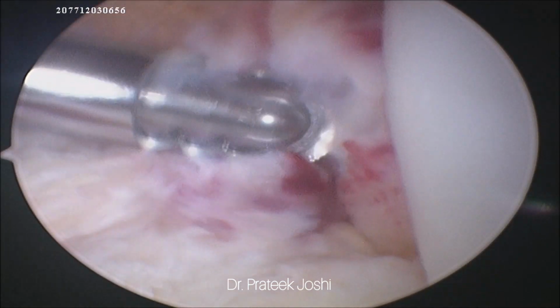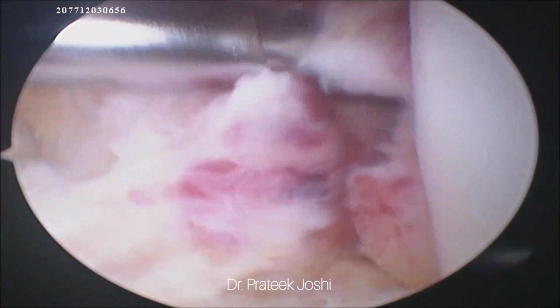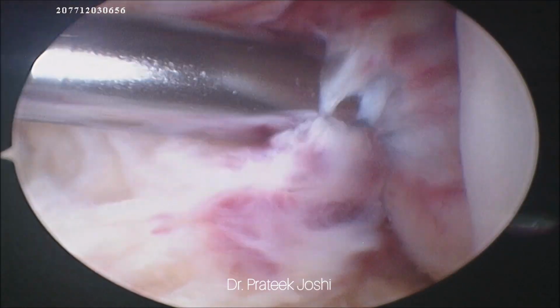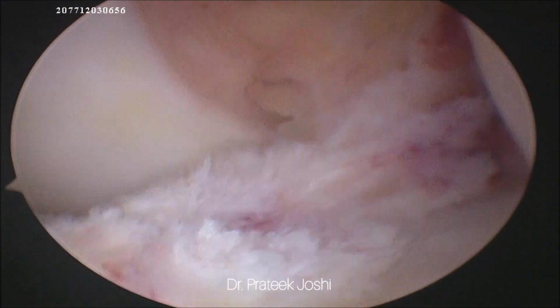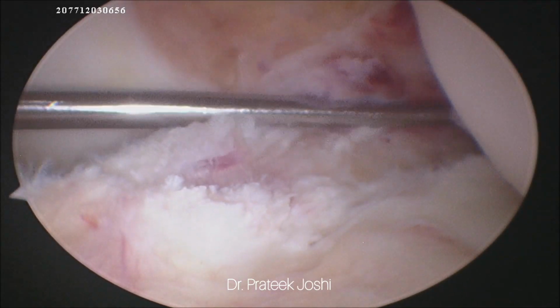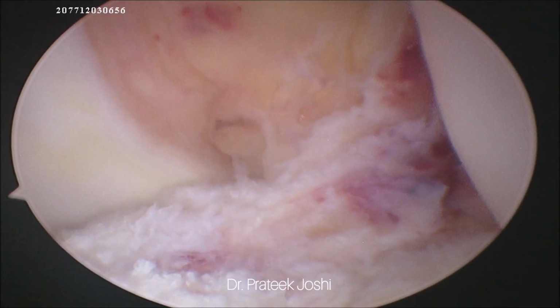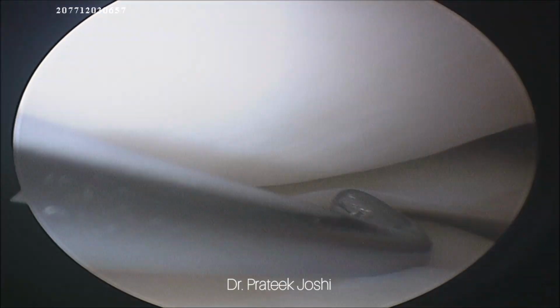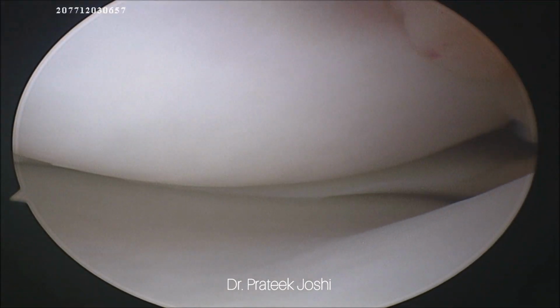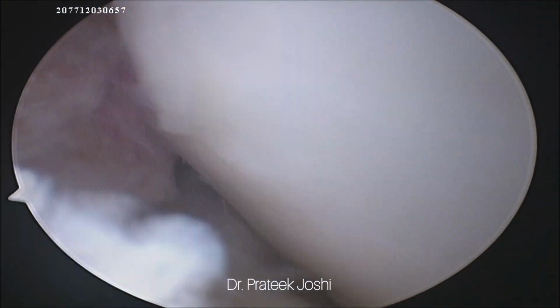And you can see now I am reaching the ACL femoral stump and I am debriding it with the arthroscopic shaver. So this is the final picture after debridement of the remnant of the ACL, and now we are going to look into the medial compartment, and you can see in the medial compartment the medial meniscus, the tibia and the femoral condyle look quite normal.